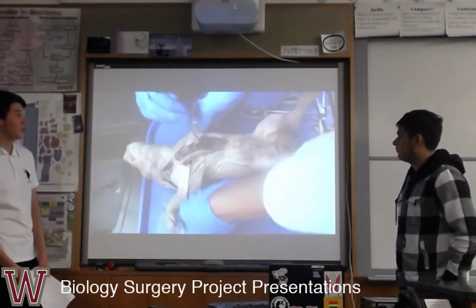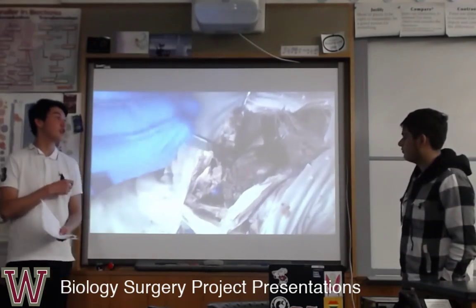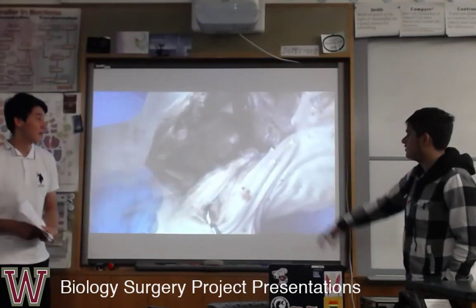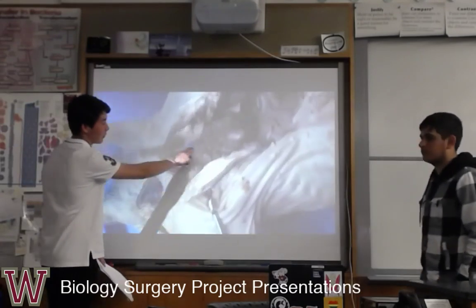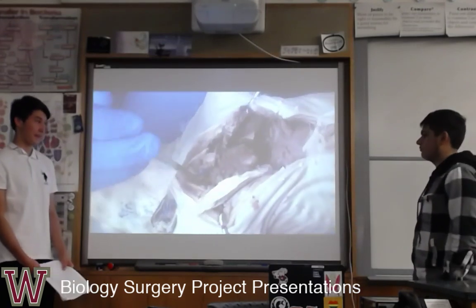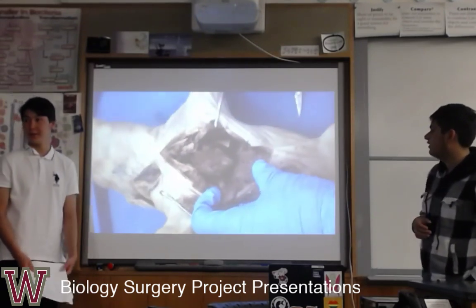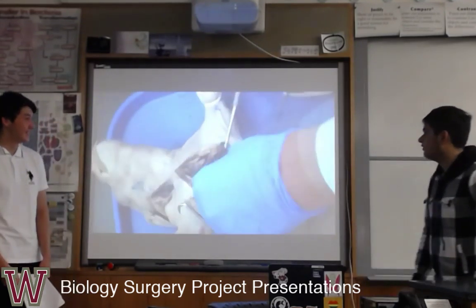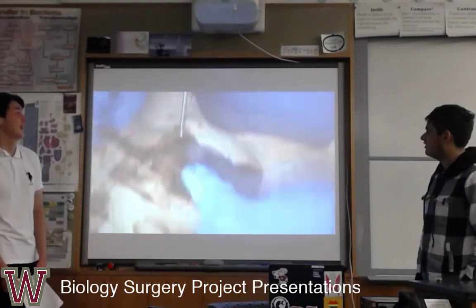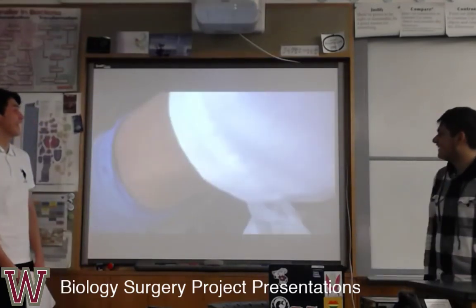And then after we can see the heart, we had six arteries and veins to cut to make sure our heart can easily come out. It was very challenging to find it inside the pig. You can see the color blue and red. We tried to cut both of them, and it was very hard to sew them back together, but we were able to do it. And as you can see, we're just trying to finalize cutting out the heart, and it is almost done and removed. Pulled out. Then we had our donor's heart.